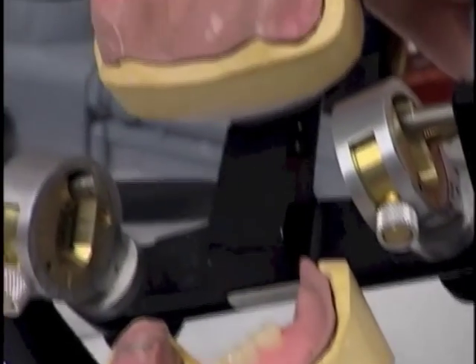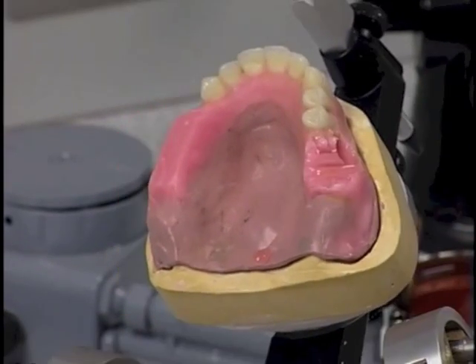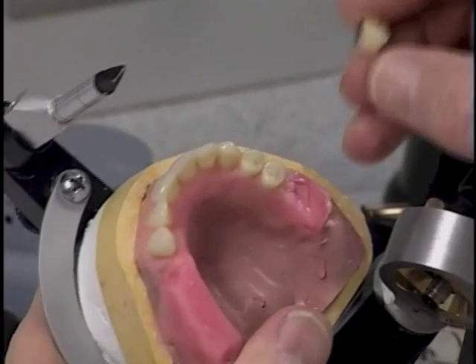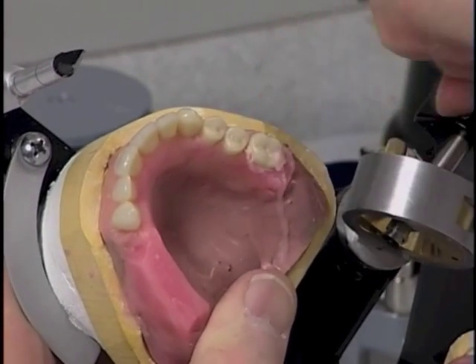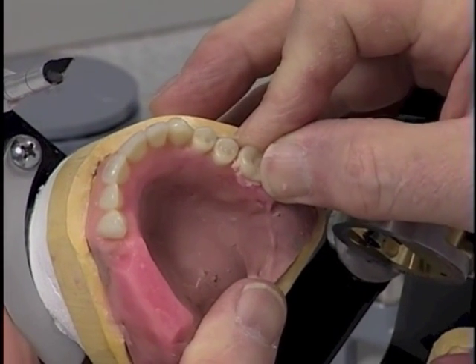So we're going to pool some wax. And now we're going to place that maxillary molar.